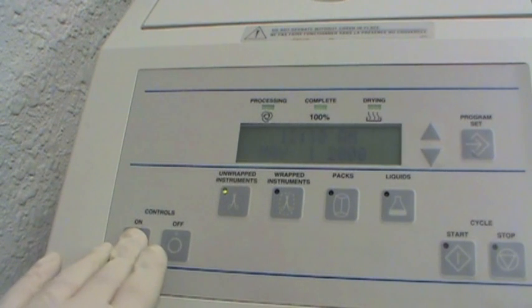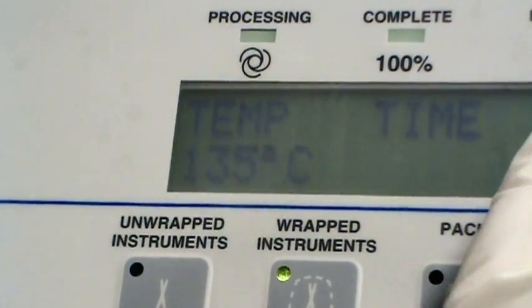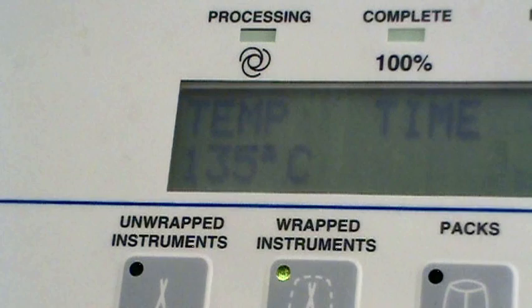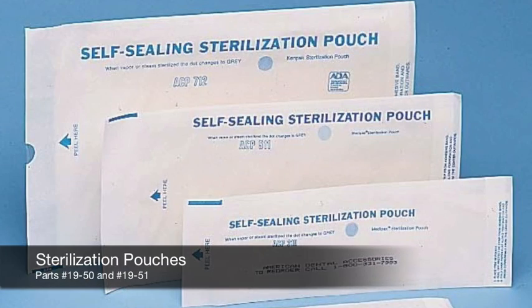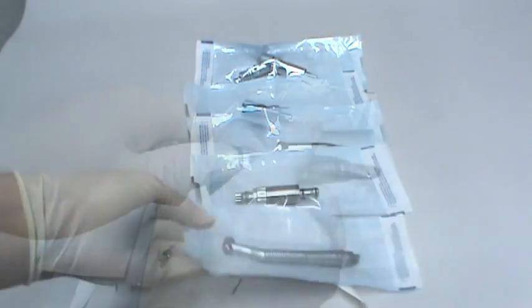When autoclaving or chemiclaving handpieces do not exceed temperatures of 275 degrees Fahrenheit or 135 degrees Celsius. Use autoclave bags with at least one paper side as they'll allow moisture to escape. Never use all plastic bags.